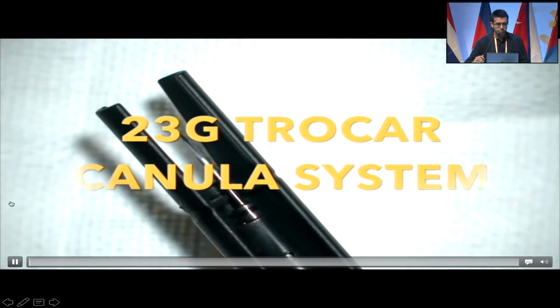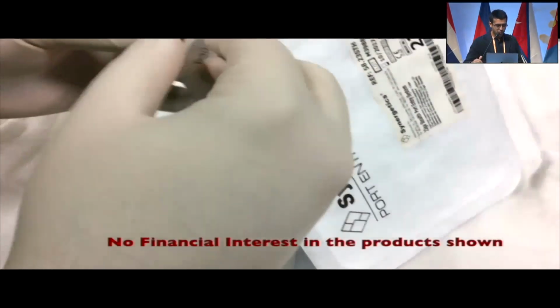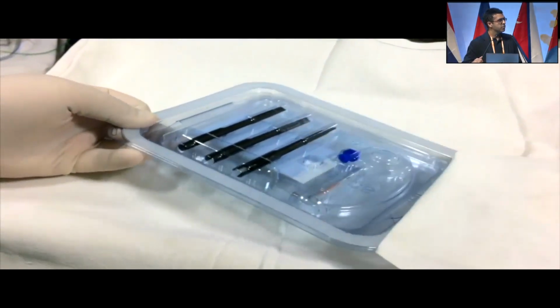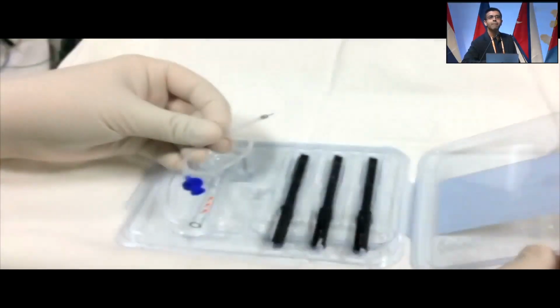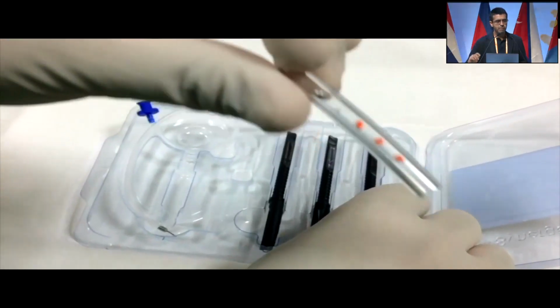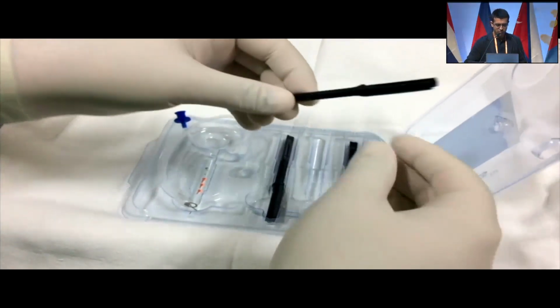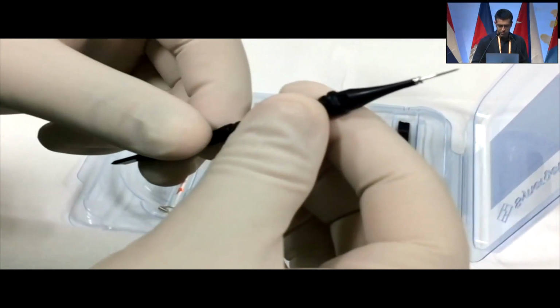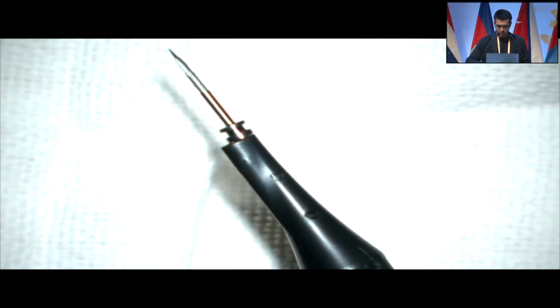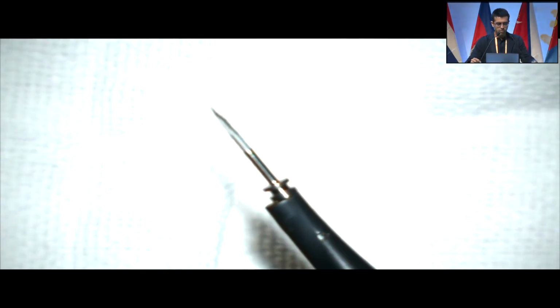23-gauge micro-incision trocar cannula system forms the backbone of this instruction course. It is imperative to understand its component and usage to fully utilize the tricks shown in the subsequent videos. A typical non-valve trocar cannula set consists of 3 23-gauge trocar cannulas, an infusion pipe, and 3 scleral plugs. Trocar cannula consists of a sharp spear-shaped trocar, threaded over which is a round-bodied cannula.